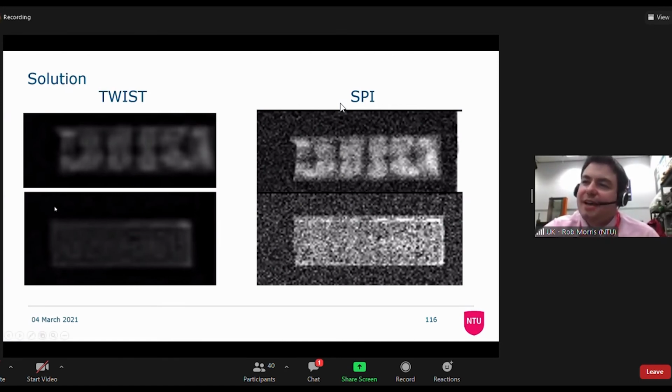So this is my flavor of the month on the scanner. Actually, it's a sequence called Twist, and it has a clever, they call it random, but it's really not random. It's quite cleverly informed sampling of k-space. It's an early implementation of compressed sensing, and it picks some clever points of k-space so it can concentrate on the bits that give us nice signals.